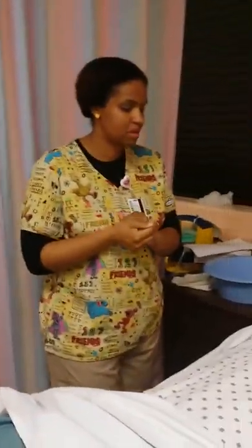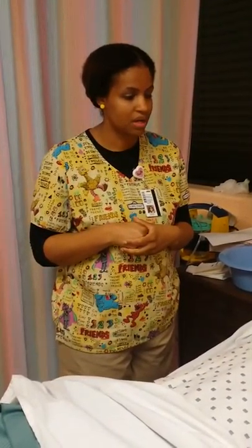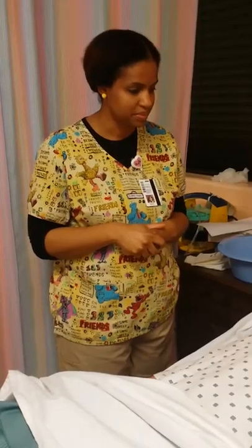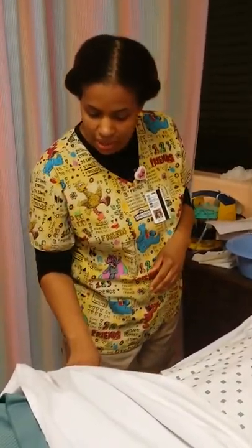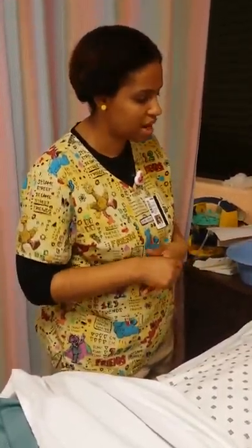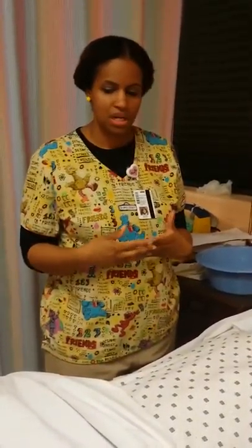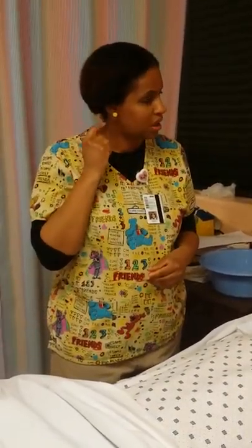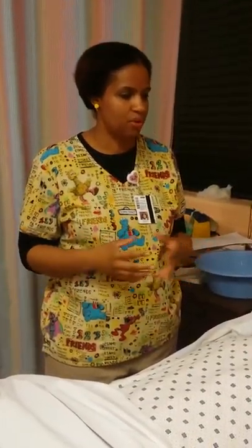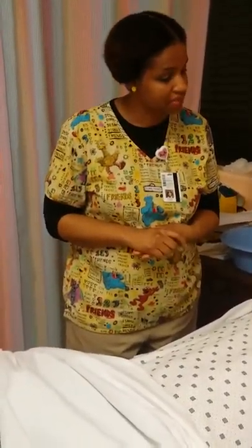Hello, my name is Camilla, and I'm going to insert a catheter on you today. First, what's your name? Joe Black. And what's your date of birth? 10/10/68. Okay. I'm not sure if you ever had a catheter inserted before, but that's what I'm going to be doing on you today. I'm going to insert that in your penis. You're going to feel a little pressure, burning, but that's normal. I'll try to go as easy on you as possible. But I'm going to go ahead and get started, okay? If that's okay with you?